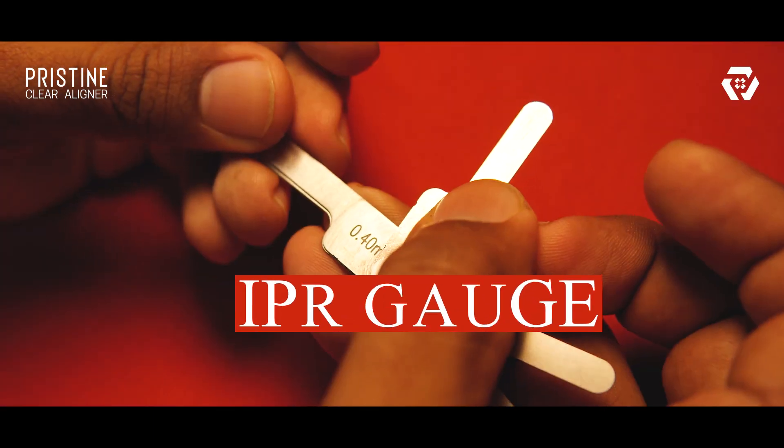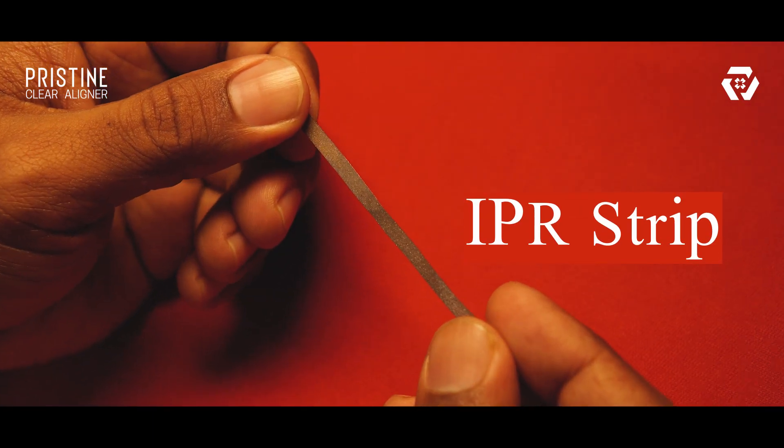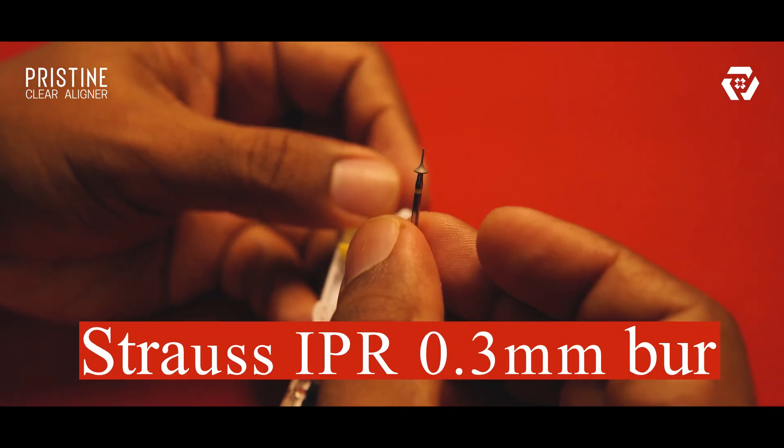Now, how do we perform IPR? First, choose your tool. There are numerous interproximal reduction burrs, strips, and discs available in the market. We prefer IPR burrs for stripping 0.3mm or more, and strips for less than 0.3mm.